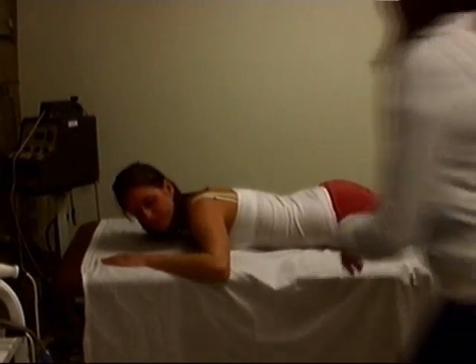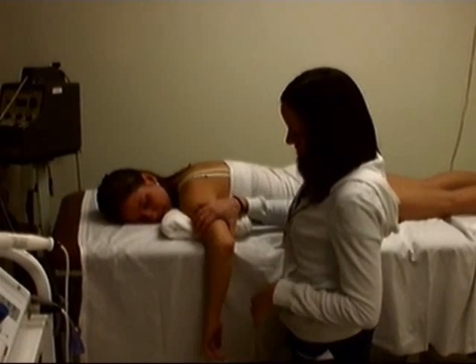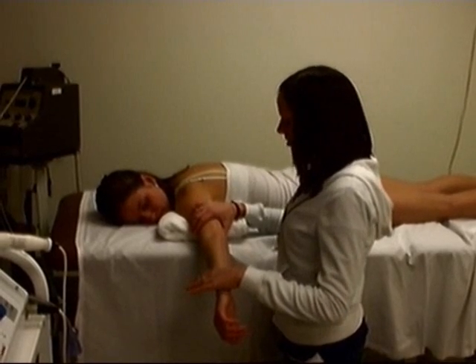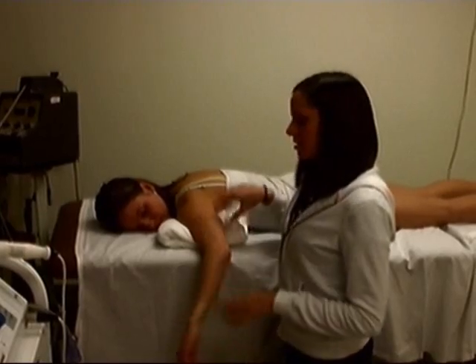Now I'm going to do elbow extension, staying in the same position. I want you to bring your elbow out. Bring it down a couple degrees so it's in its locked position, hold it there, and don't let me push it down — one, two, three. Five out of five.